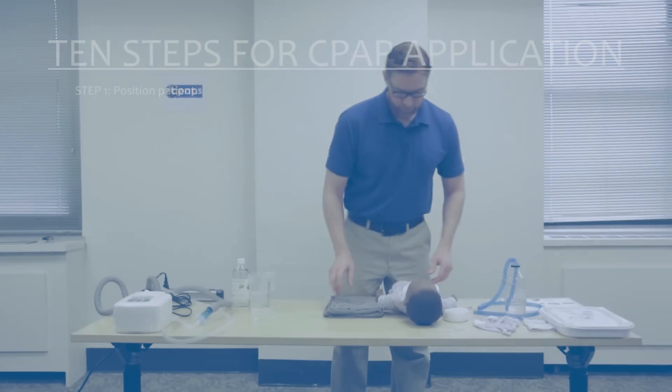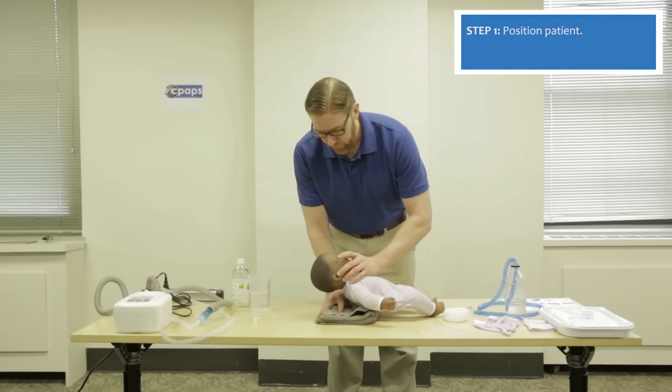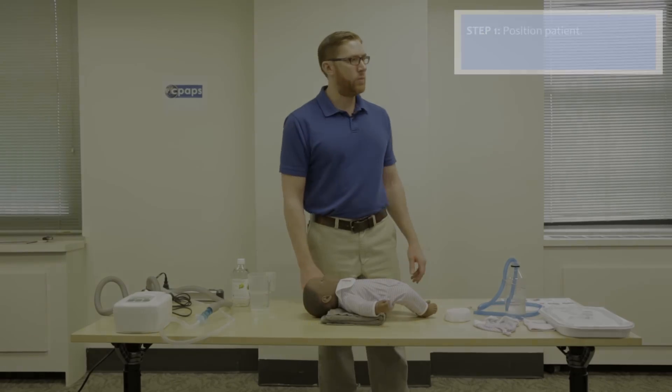The next step is to prepare the patient. In this case we have an infant. Position the infant so the airway is open by placing a small towel behind the shoulders. This allows the patient to have an open airway, or be in the sniffing position.